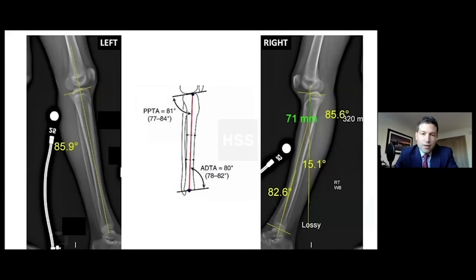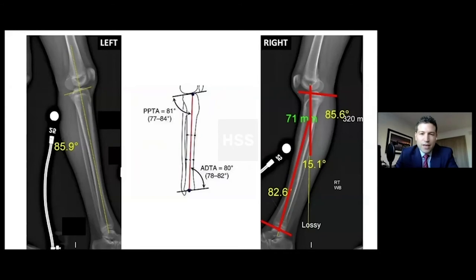You can help make your osteotomy there and also determine how you want to treat this. I'm dropping down a PPTA that is normal, about 85 degrees, and sending up an ADTA of 82 in this case. Then you can measure the magnitude of the deformity — in this case, 15 degrees. I can check where I'm going to make my osteotomy and measure 71 millimeters from the joint line.